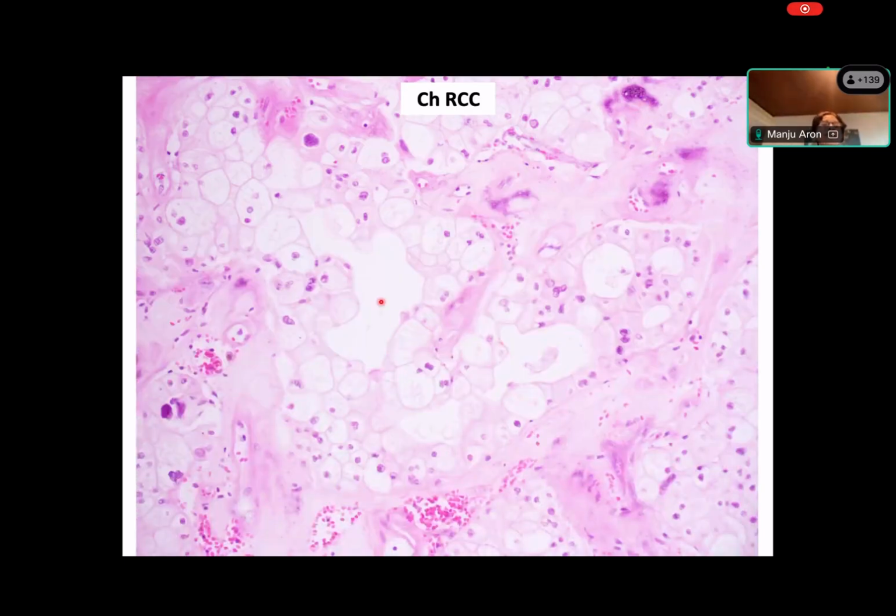There's also an example of a chromophobe RCC. You can see the nuclear features. You can see binucleation very often in these tumors. You can get large areas of hyalinization sometimes, especially in the center.